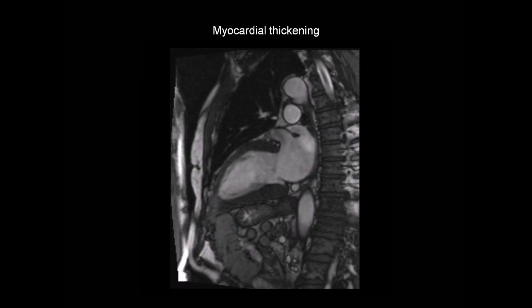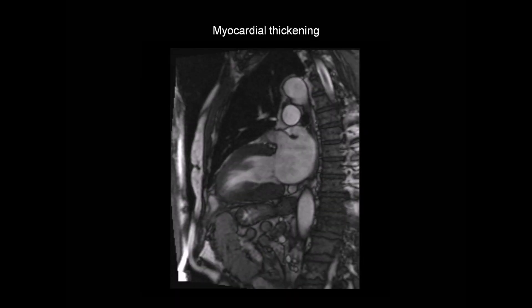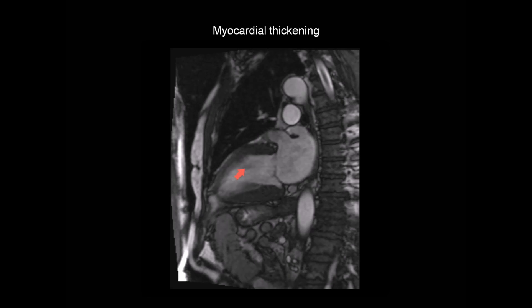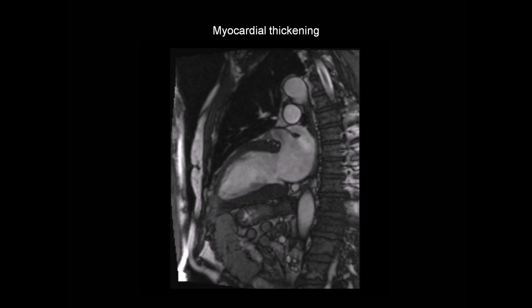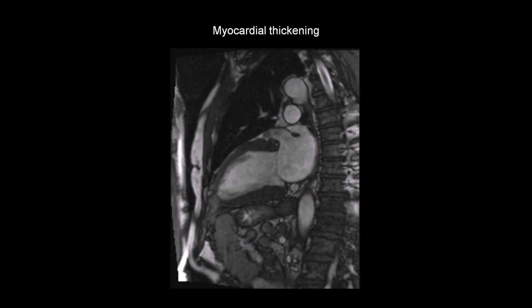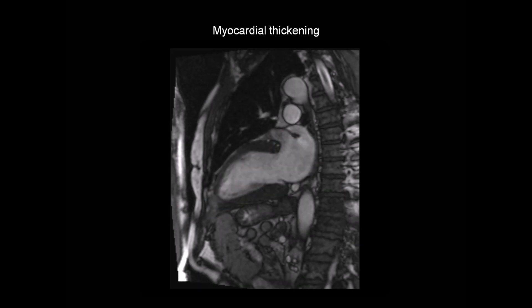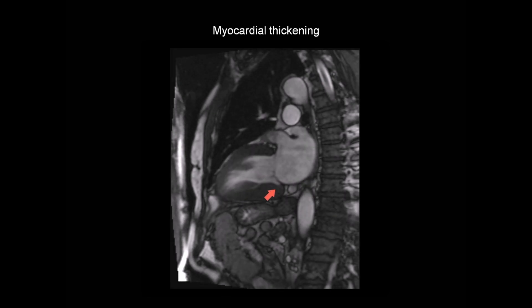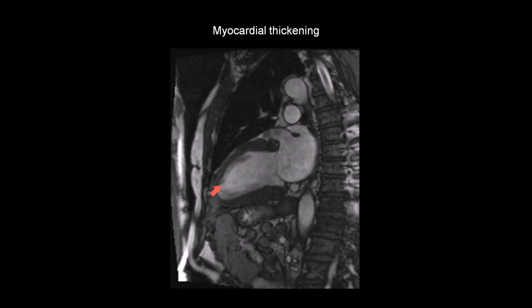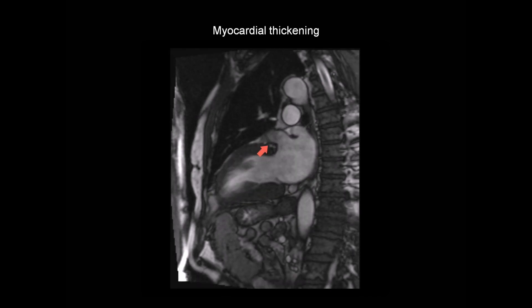This is a cine CMR image showing a two-chamber view of the heart — the left ventricle, mitral valve, and left atrium. This is from a 74-year-old man with cardiac amyloidosis, and we can see thickening of the myocardium, which is concentric throughout the whole of the left ventricle.